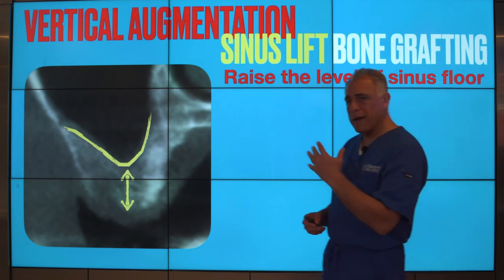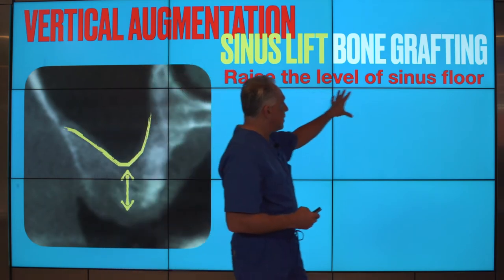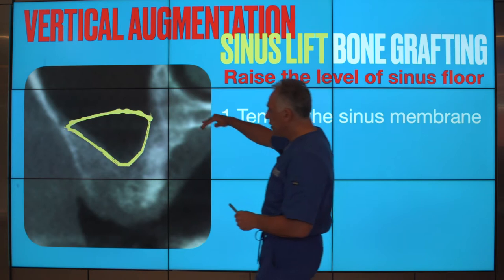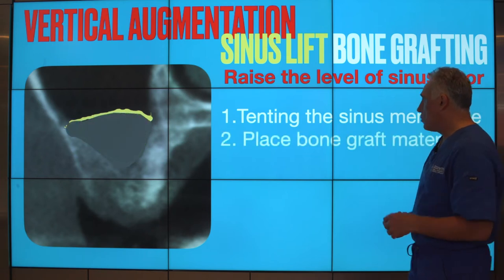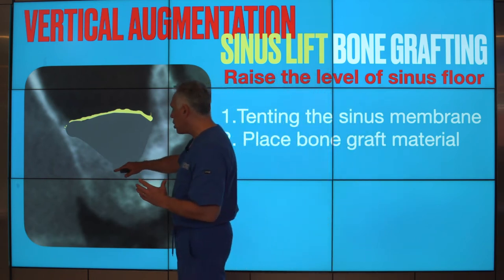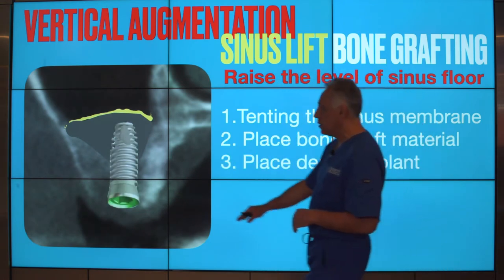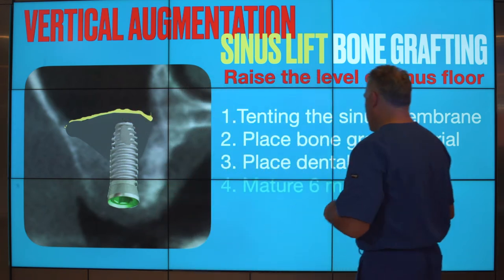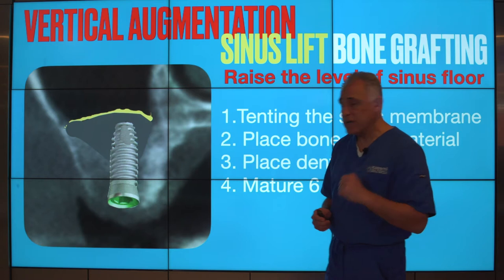Now, let's talk about what sinus lift bone grafting is. It is simply a technique to raise the level of the sinus floor. And this is how it works. The first step is a technique that allows us to tent the sinus floor membrane. Next, we place a bone graft material in the area created between the jawbone and the new level of the sinus membrane. Next, we place the dental implant, of appropriate size and length, with adequate separation from the sinus floor, and let it mature and heal for about 6 months before it is ready for the restoration.